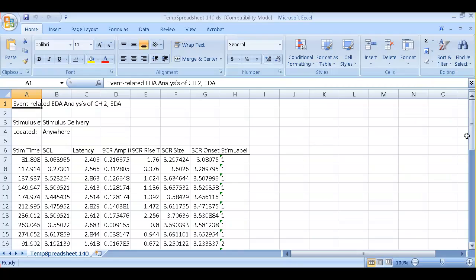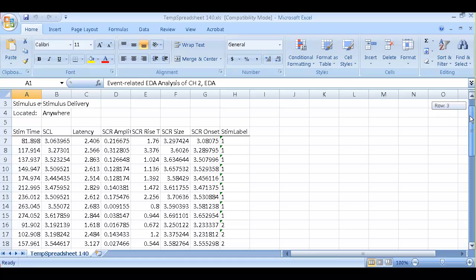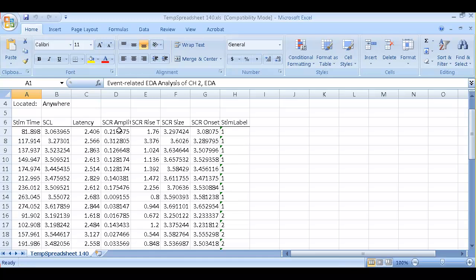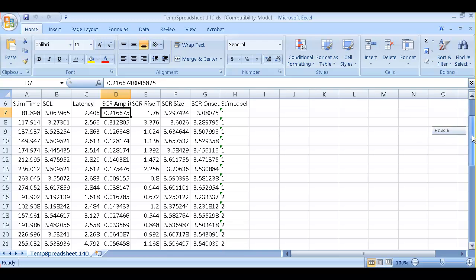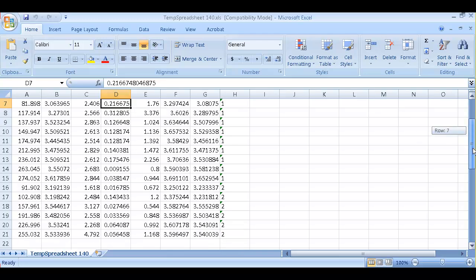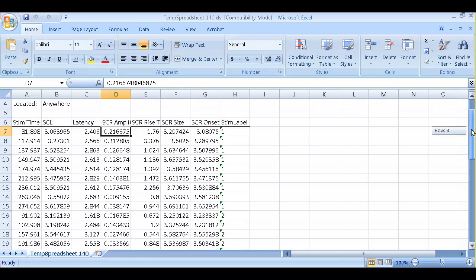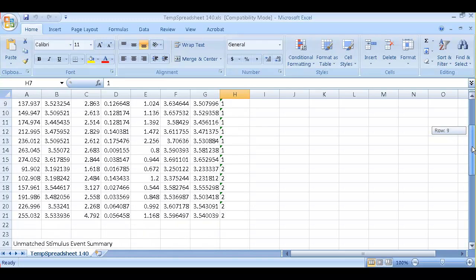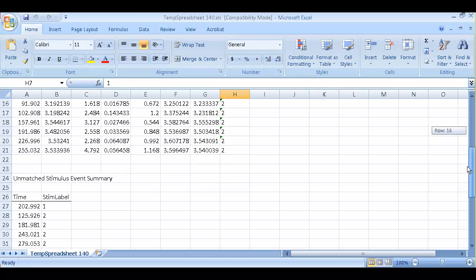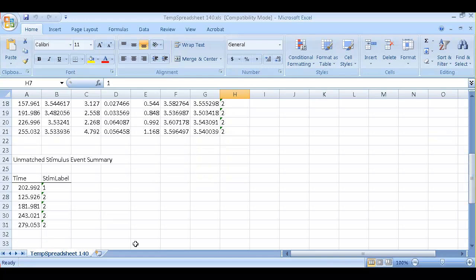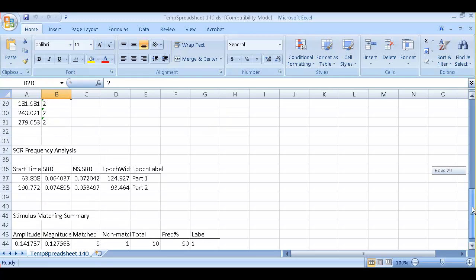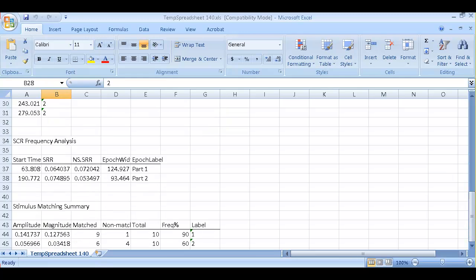Let's have a look at the table that's generated. It contains the amplitude, most importantly, as well as other statistics for each stimulus that did result in a specific skin conductance event. We can see what was the stimulus label. As you remember, one corresponds to scary events, and clap sounds are number two. We can see which stimulation instances did not result in a skin conductance response. We have this table here that gives us the amplitude and the magnitude, as well as the frequency of response to the different types of stimulation.